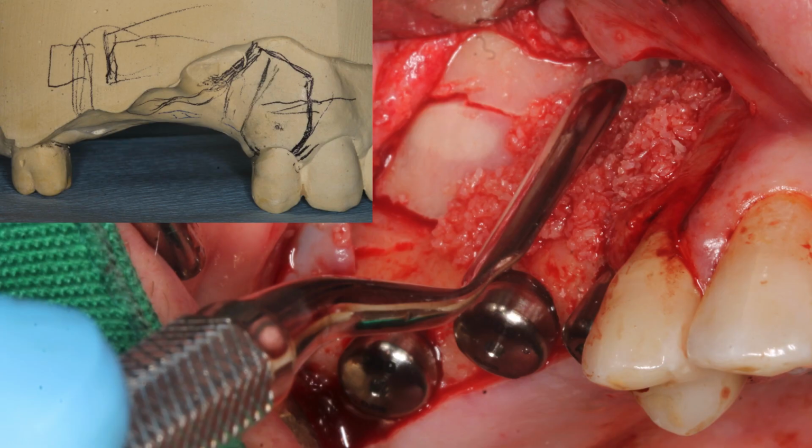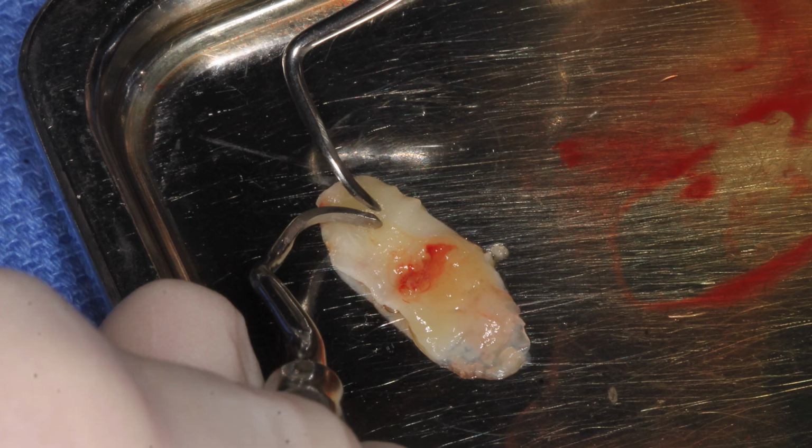Basically, that area we decided to patch and grow some bone because it's a deep void valley. There's a very good potential for the bone to grow, so we threw some extra sticky bone into that area, and of course the bone surface of the ridge was prepared in order to receive that. And then the next fun part is this poncho process.